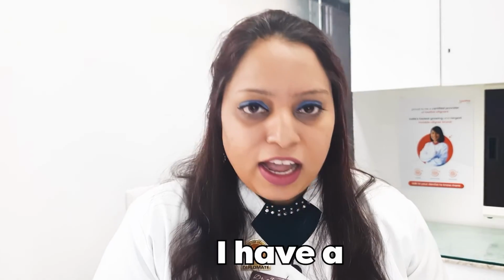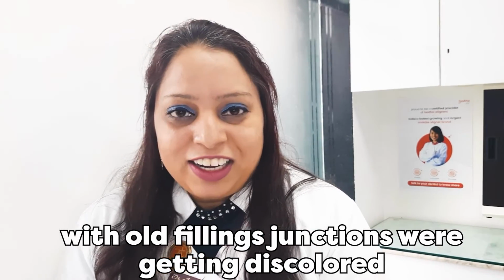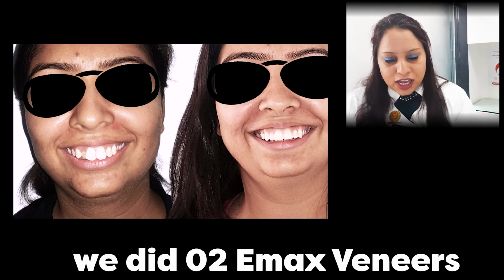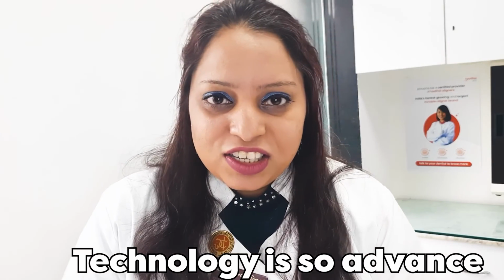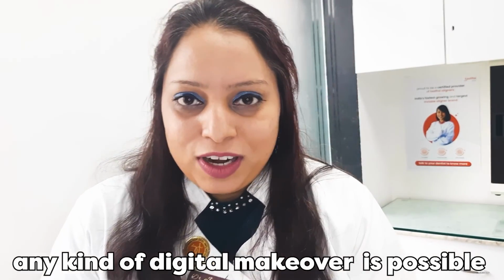In the end, I have a patient who was not happy with the old fillings. The junctions were getting discolored. There were decays happening around the fillings. We did 2 Emax veneers for her. Technology is so advanced that with CAD/CAM technique, any kind of digital makeover is possible.